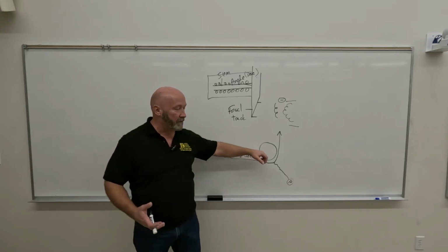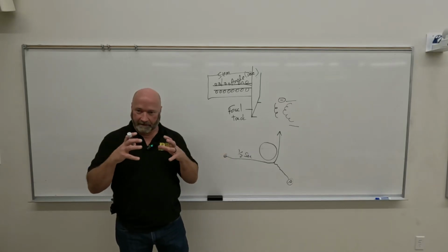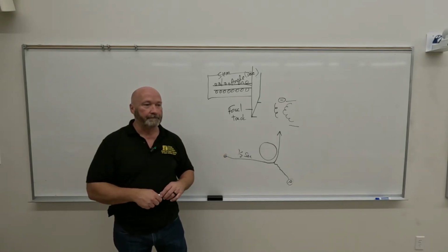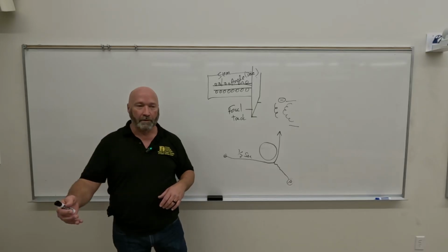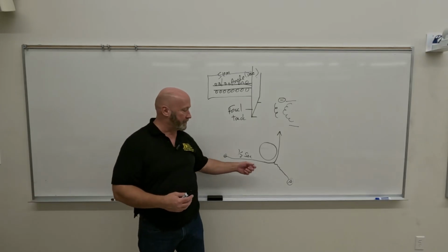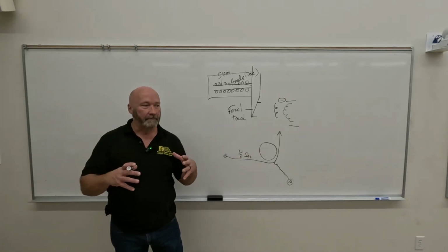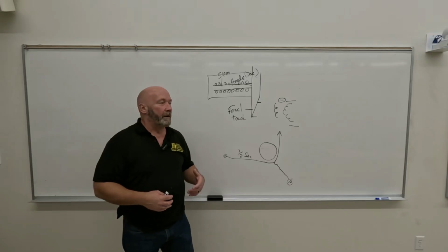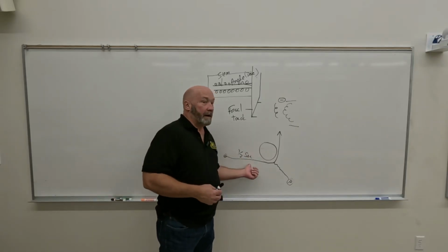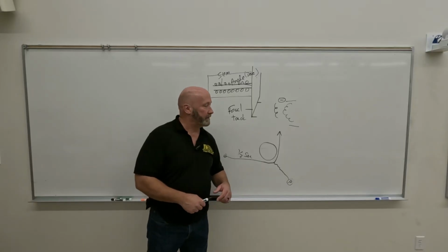Weight-wise it did, nucleus-wise it did. But what happened was they got closer together, right? So we've got more electron targets, not really considering that we're just shooting for the inner shell, but they're tight, right? So we've got more efficient brems by a long shot, maybe a little bit more efficient characteristic as well.